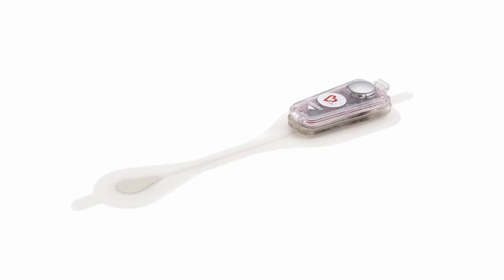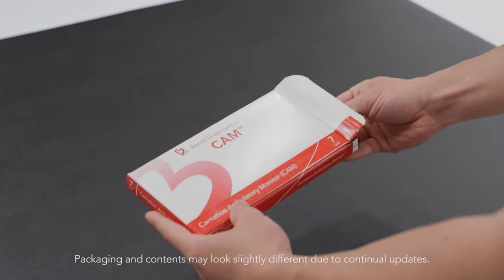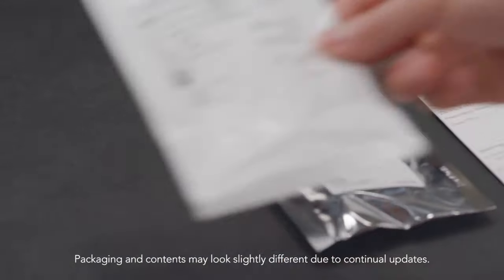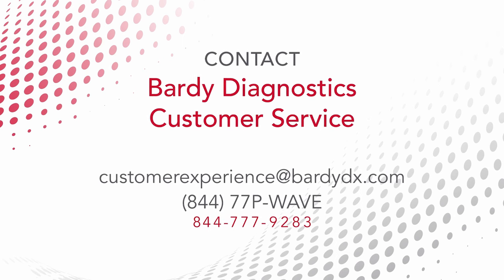To ensure optimal recording quality and to achieve full duration of the prescribed wear time of the patch, it is essential that the following application instructions be adhered to closely. Locate a clean area that has a flat and firm surface large enough to lay out the contents of the CAM box. If any item is missing, contact Bardy Diagnostics Customer Service.